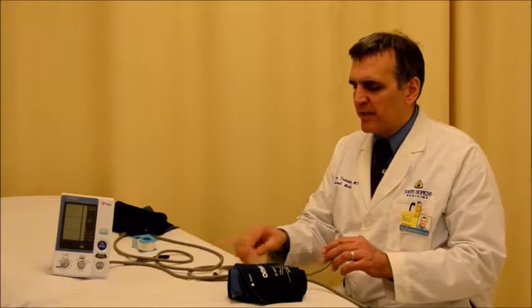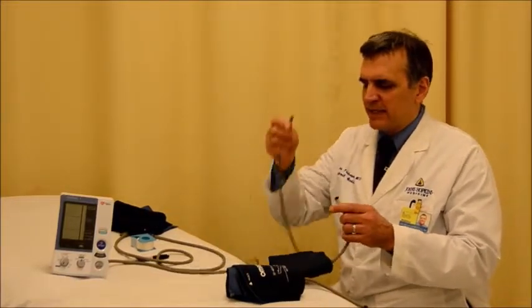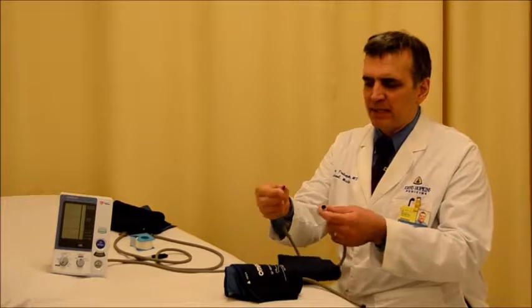There are four different cuff sizes with the Omron 907. There's a small, medium, large, and extra large. The small, medium, and large have tubing that has a black plastic coupling in the middle of it.